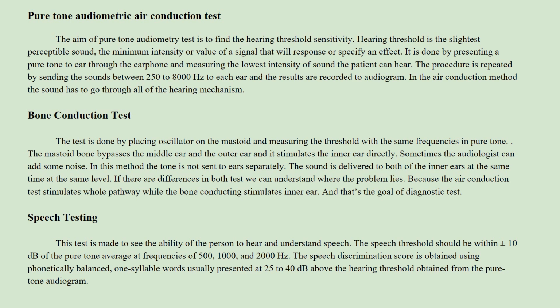So intensity of sound is the power carried by sound waves per unit area. The higher the intensity of a sound, the louder it is perceived in our ears. The test procedure is repeated by sending the sounds between 250 to 8000 Hz to each ear separately, and the results are recorded to audiogram.